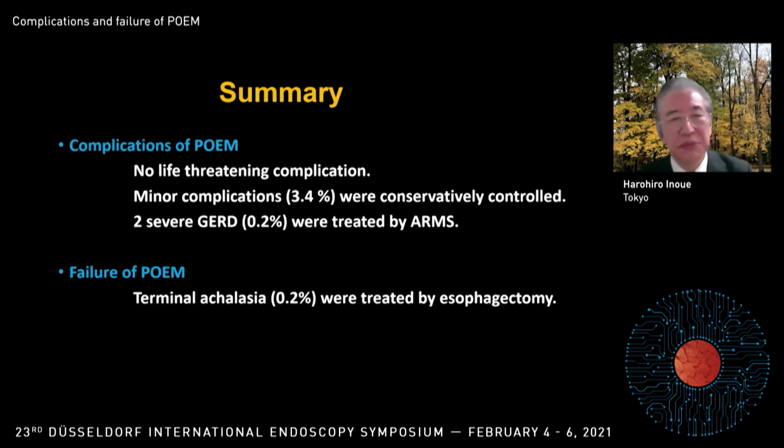Ladies and gentlemen, this is my summary of this presentation. Regarding complications of POEM, we don't have any life-threatening complications. Minor complications occurred in 3.4%, and all of them were conservatively controlled.